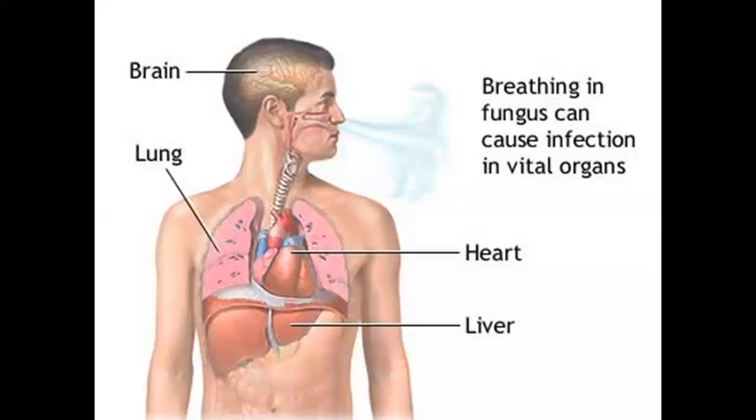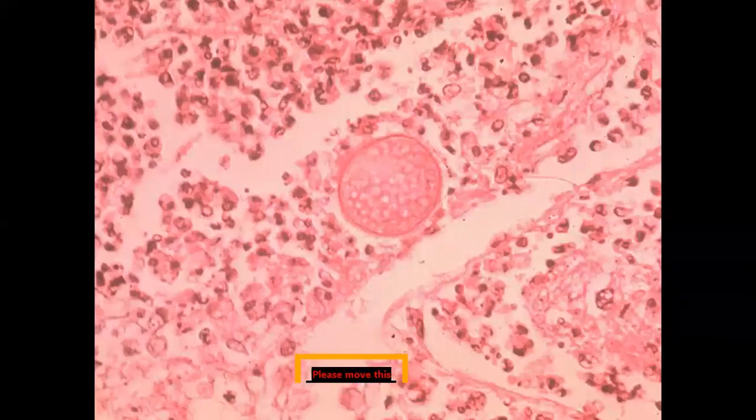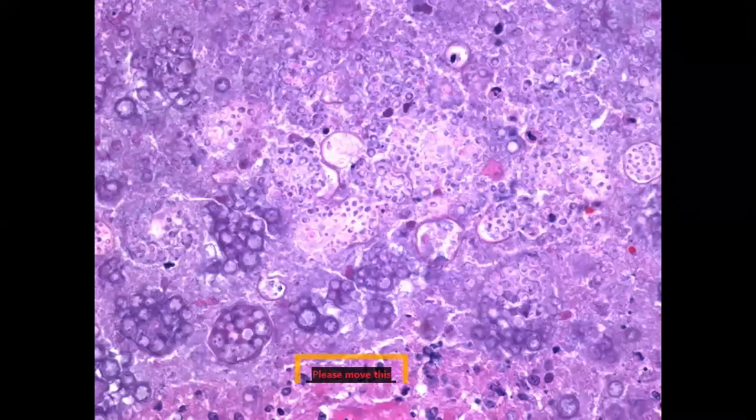So this is coccidioidomycosis, or Coccidioides immitis, a lot of fungal spores present in a membrane. So it can form budding fungi whenever the spores are out of the membrane, and they can cause a disseminated infection. See this, this is a tissue slide stained with hematoxylin eosin. So you can see the fungus again. So this is hematoxylin eosin.